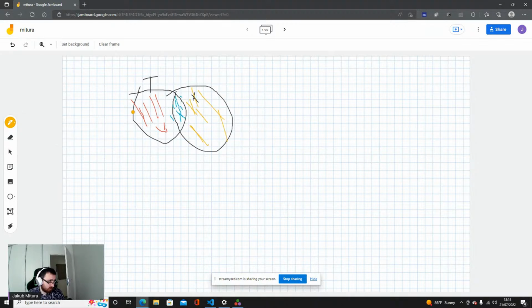So we have the true positive part, the false negative, and the false positive. This is basically how the dice score looks. And Jaccard and a lot of others are based on the same idea.